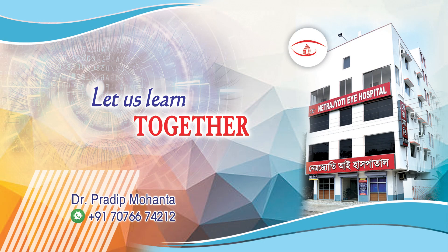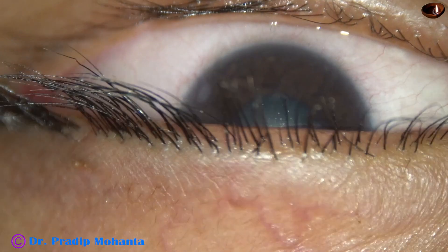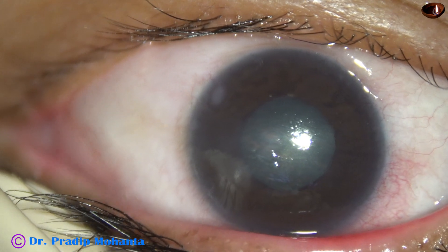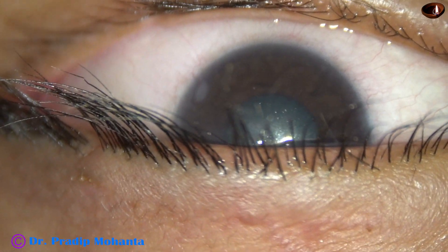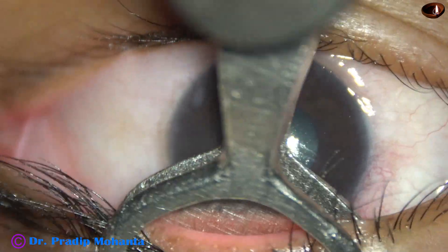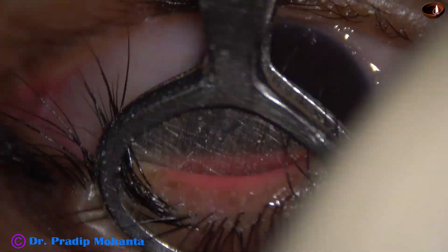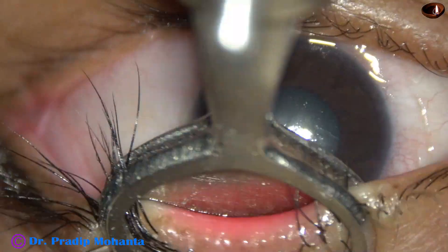In this video we are going to see permanent tarsorrhaphy. This patient is a 46-year-old lady who has severe exposure keratitis following Bell's palsy, and we have decided to do permanent tarsorrhaphy at the center of the eyelid.